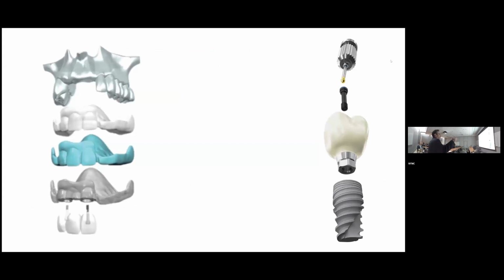And so this is basically on the right here, you have the implant on the bottom, you have a crown, and then we literally screw the crown right into the implant. We used to use a lot of cements when we didn't know where the implant was, and now we can design them so the screw channel of the implant comes out in the exact right place so we can screw it straight in. So we don't have to cement things in. It's more retrievable if something breaks. It's a much better system.